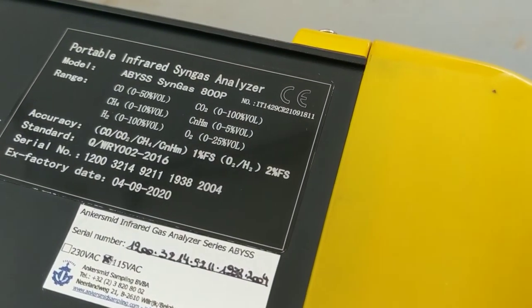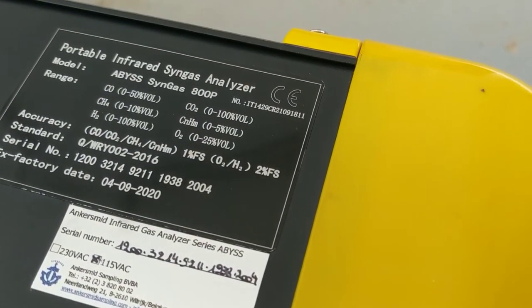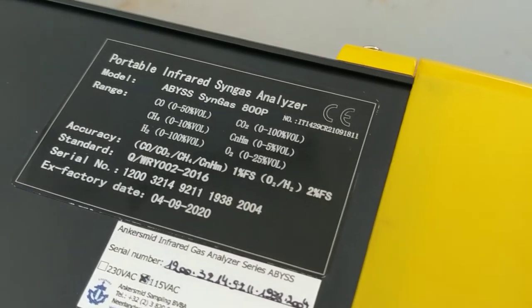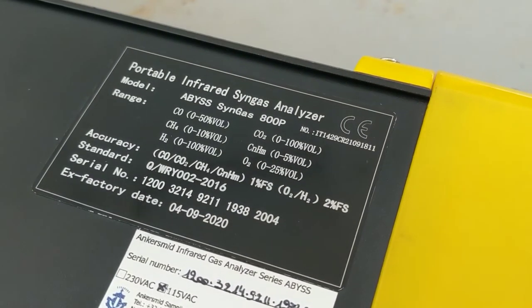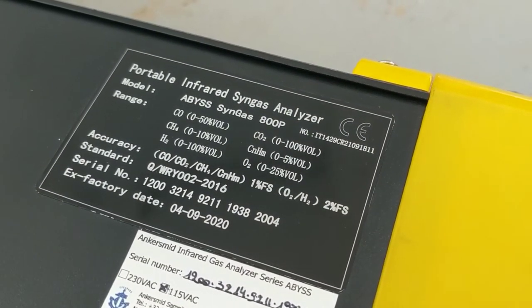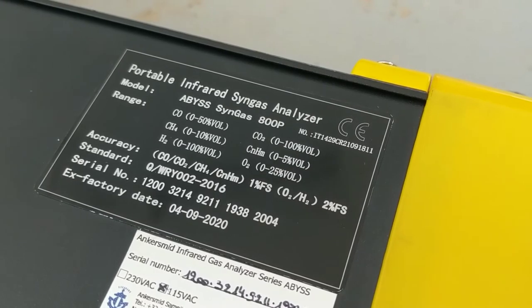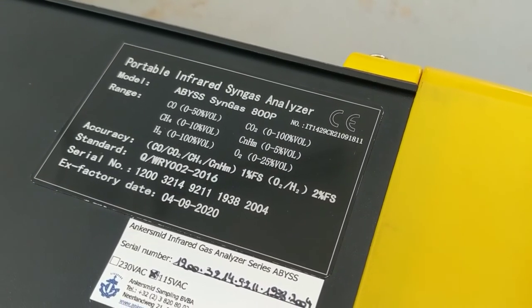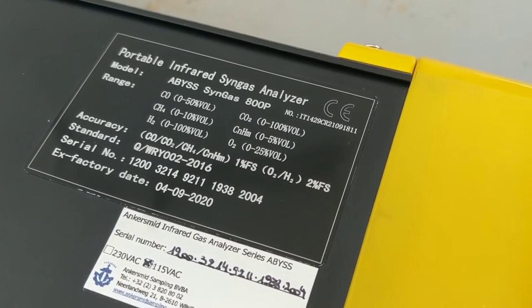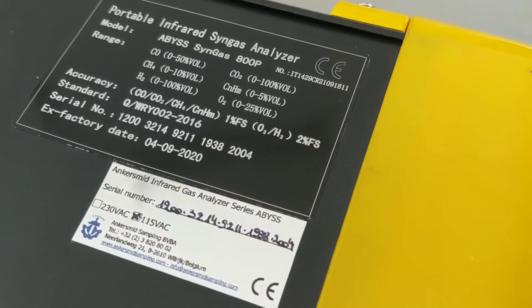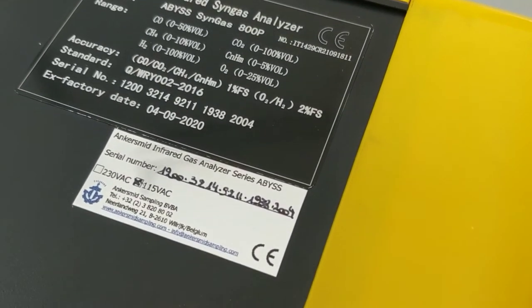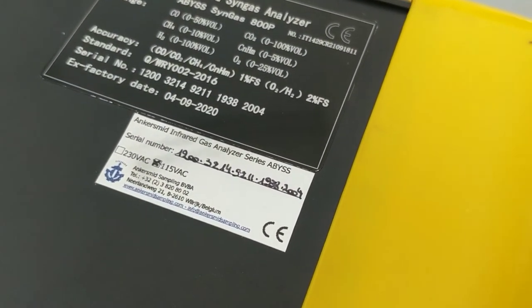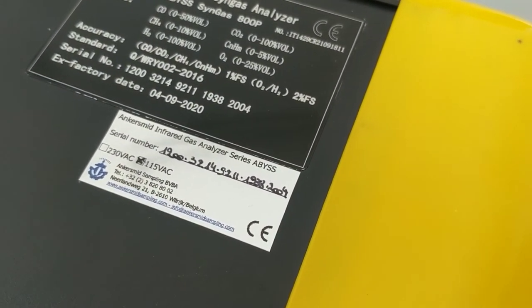Got our ranges on there. H2 zero to a hundred percent. Carbon monoxide zero to fifty percent. Factory date April 9th.